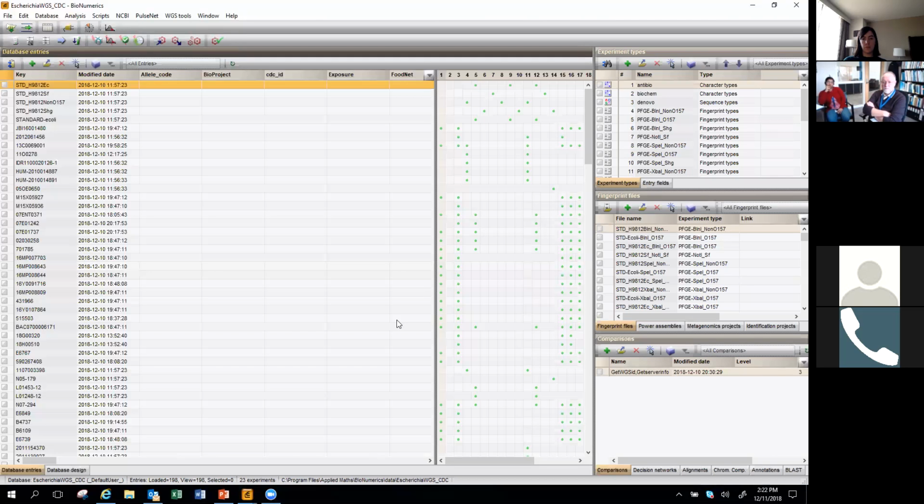So this is what the new Escherichia database will look like. This is a combined database with both PFGE and WGS data. We have a lot more experiment cards now, as you can tell. Escherichia is a big one because it now combines with the Shigella databases. So all these dots represent present experiments that are associated with the number up here.